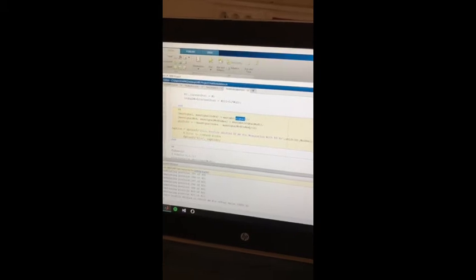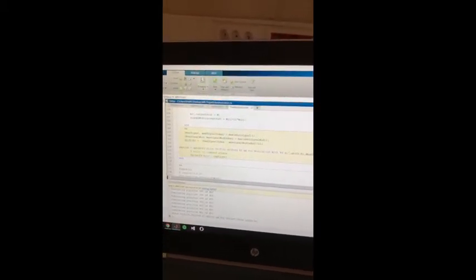And as you can see, the frequency inside it is a variable as well, mod val. This mod val ranges from 25 Hz to 500 Hz. There are 20 values inside it. So for these 20 values, I find the shifted magnitude profiles. Then, similar to what I did with the offset, I find the max of the original signal and the max of the modulated signals. I subtract the indexes from each other and divide by 10 to turn it into the millisecond scale. And as you can see, I will now show the results.